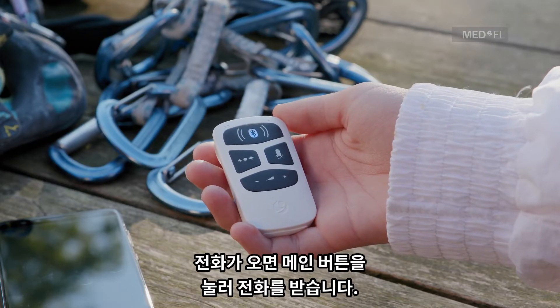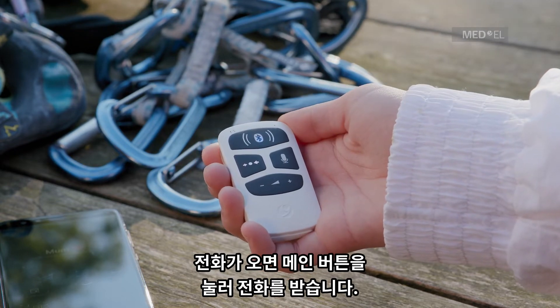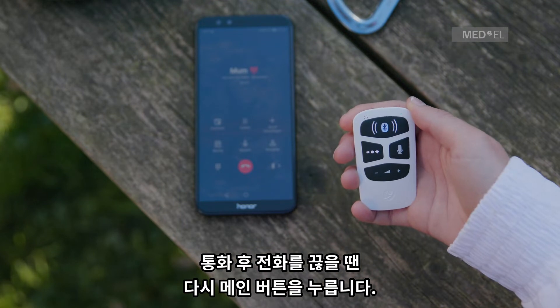If you receive a call, press the main button to accept the call. To hang up on an active phone call, press the main button once.